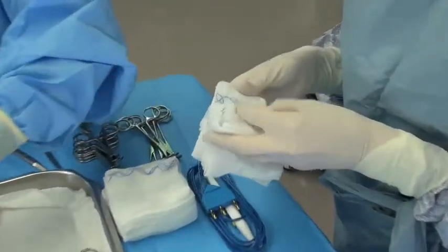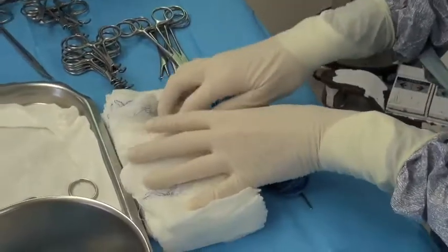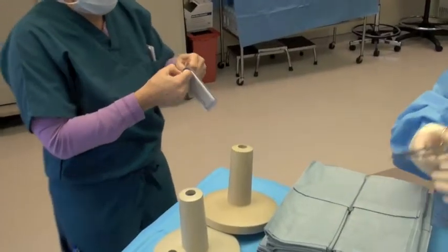This is also a good time to go through your instruments to make sure everything is in place, as well as counting the sponges. As you can see, the assistant is making sure that everything is there and that they relay that to the anesthesia person.